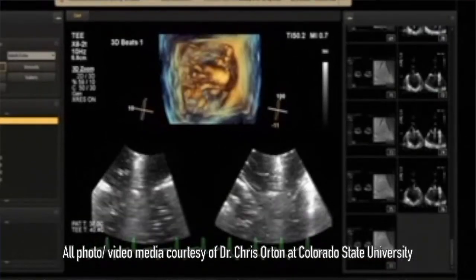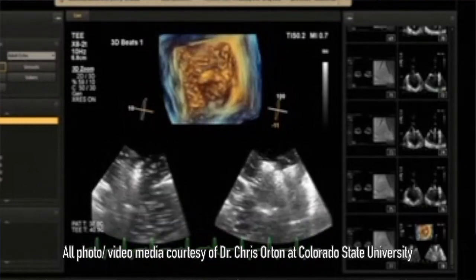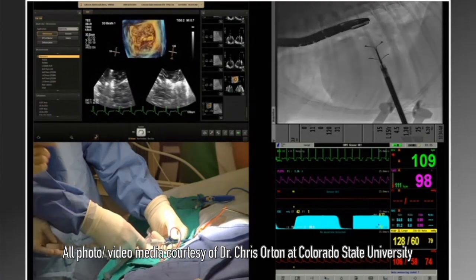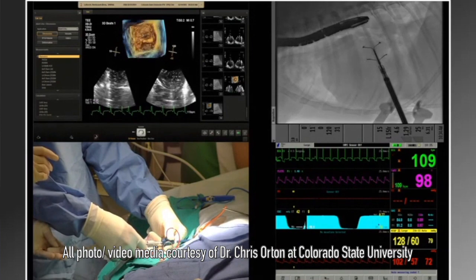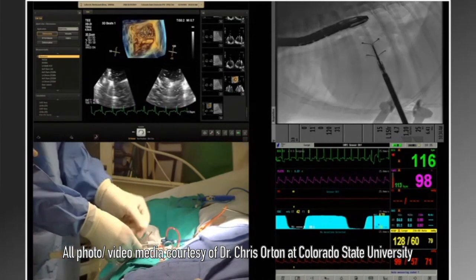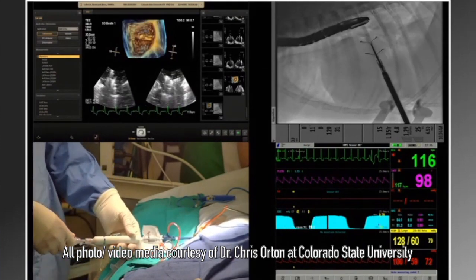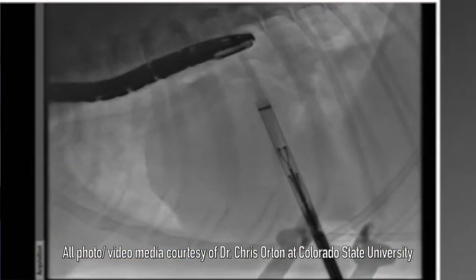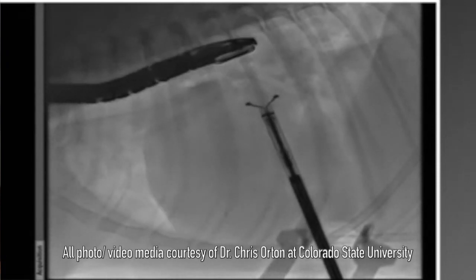There are three different views that the ultrasound gives us: two two-dimensional views, and actually a three-dimensional view as if you're looking down on the valve. The ultrasound probe — you feed that down the esophagus, right, over the heart while the patient is anesthetized. That's right — it's transesophageal echocardiography. The probe is actually right next to the heart, which gives us the best view. We also use fluoroscopy, which shows us the actual device as it's being manipulated — almost like a video x-ray so you can watch the device as it's advancing.